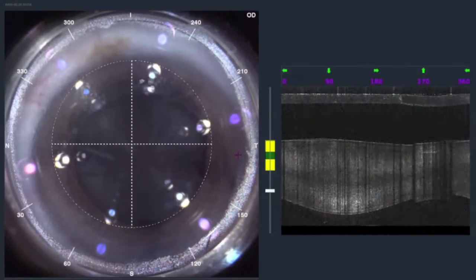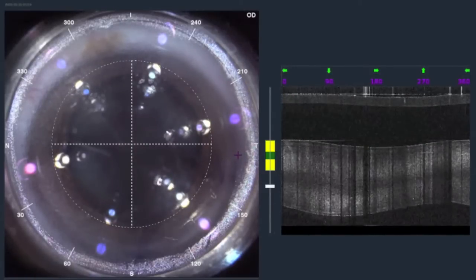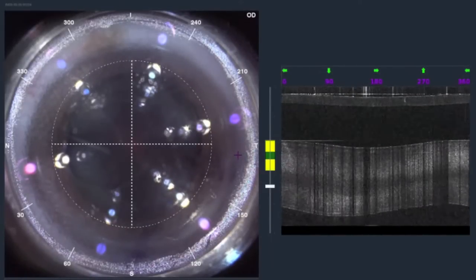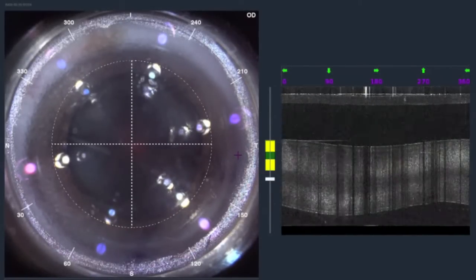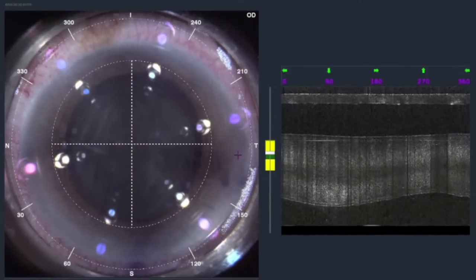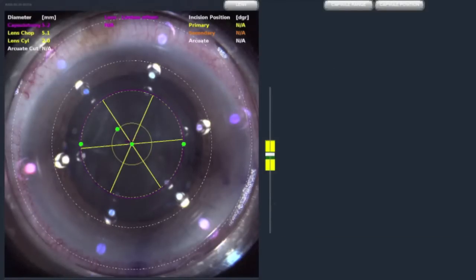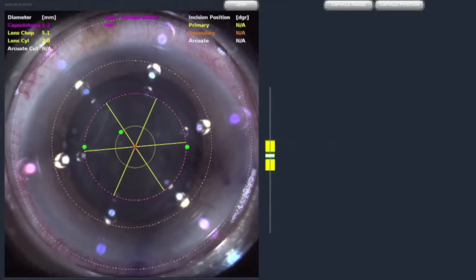Now the patient is looking at the red blinking light, and he can see that despite the cataract and the radial incisions. On the right side of the screen, you can see the imaging of cornea, and then soon the lens begin. Now, when the docking mechanism is engaged, you can put your pre-planned incisions overlay on the actual real-time picture.